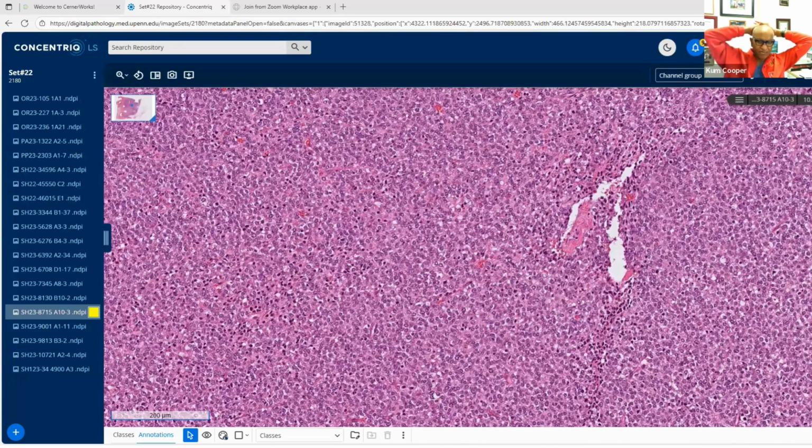This is a CIC-rearranged sarcoma, and I promised you that I was doing a WT1. WT1 is positive in these. So be careful. The WT1 most of us have is the WT1 we use for mesothelioma and serous carcinoma of the ovary, and then the CIC sarcomas. It's the N-terminal WT1, because there's a C-terminal, and that's positive in desmoplastic small round blue cell tumor. So be careful. Don't try to use the N-terminal WT1 for a case where you're querying desmoplastic small round blue cell tumor.